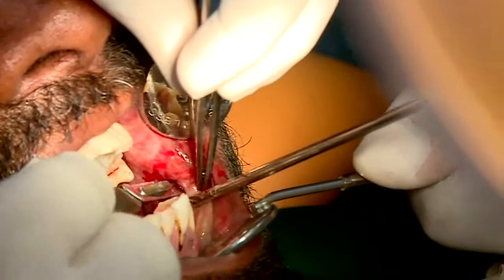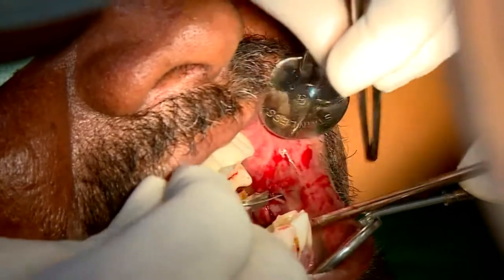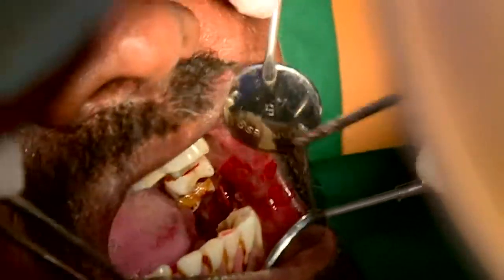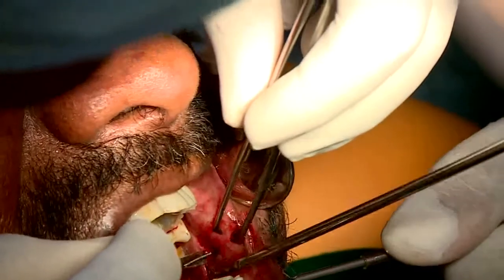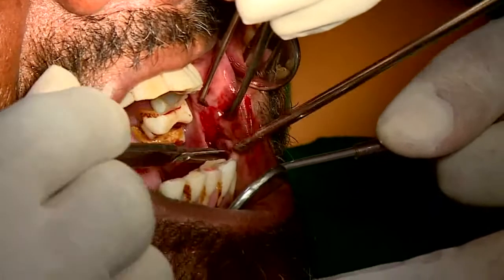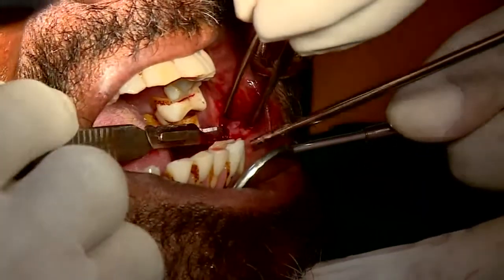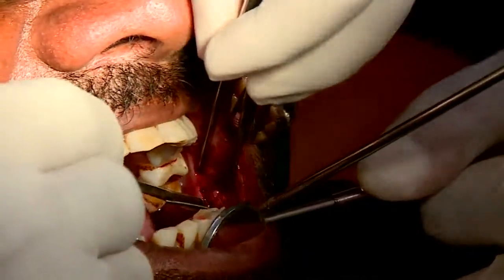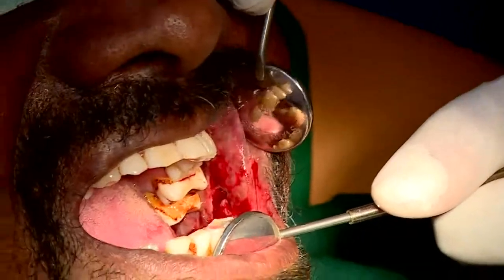Just trying to connect all the edges together now so that I can get an equal depth specimen everywhere. So I have finished three incisions now. The posterior, the superior and the inferior incisions are done. Now I need to just make the anterior cut. When you start coming to this point, try to keep the suction a little away because the specimen might get stuck. Then the whole point of the biopsy is lost.